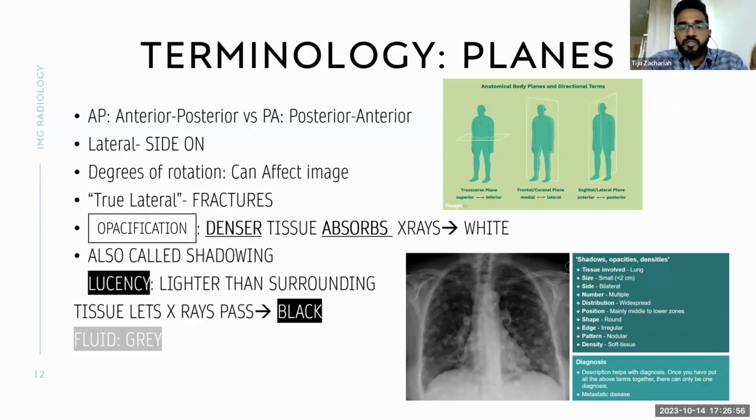So coming back to what I started off with, denser tissues absorb more X-rays, and lucent structures, that is, structures that contain more air or fat, will let more X-rays through, which will look more black. If we imagine a scale, the thing that lets maximum radiation through will be air, so air will come as black. On the other extreme, white will be the most radio-dense material, which is obviously metal. So the most white thing will be metal.